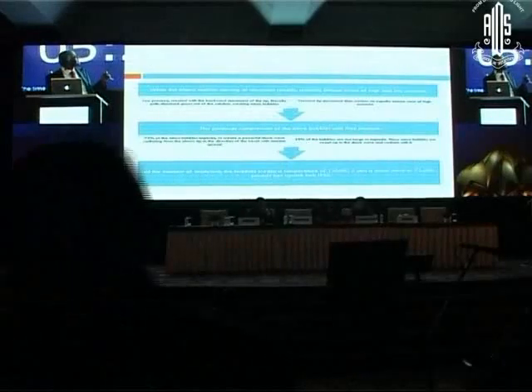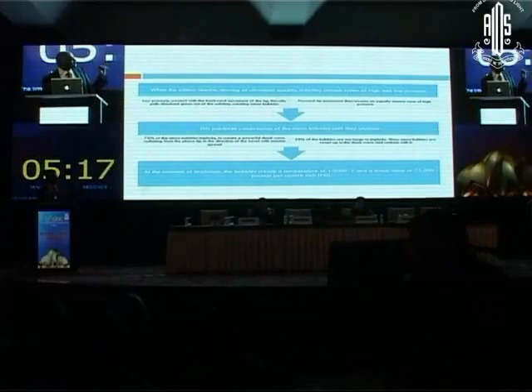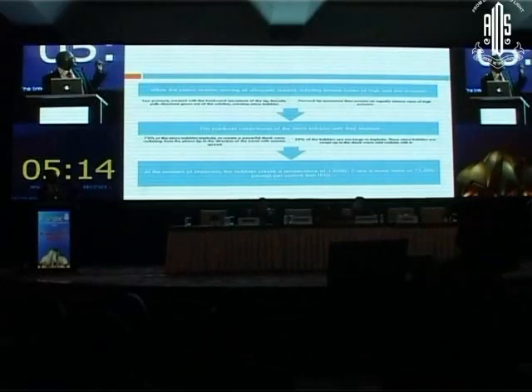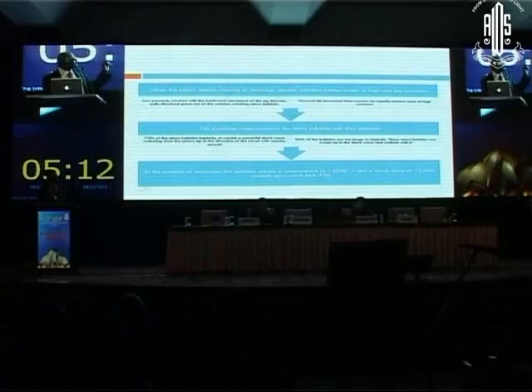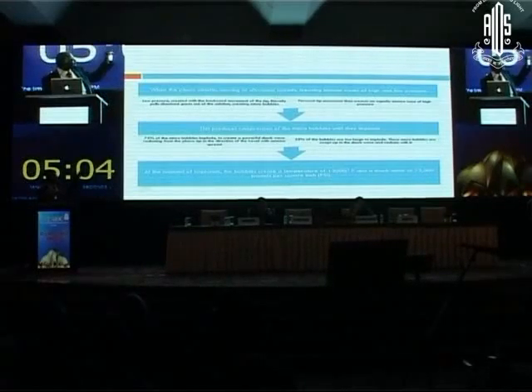Now here, when the phaco needle moves at ultrasound speed, it cuts through intense zones of high and low pressure. Here you can see low pressure created with the backward movement of the tip, which literally pulls the dissolved gases out of the solution. It means the solution creates micro bubbles.